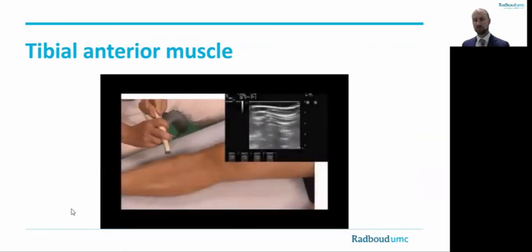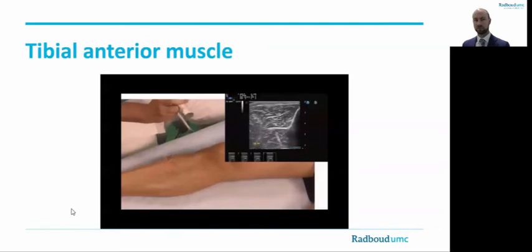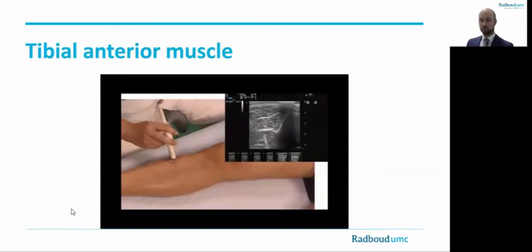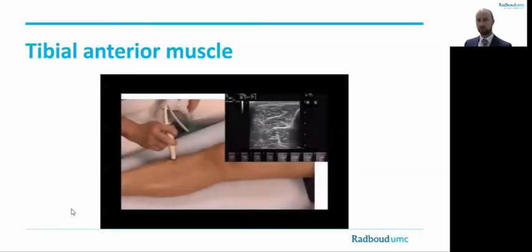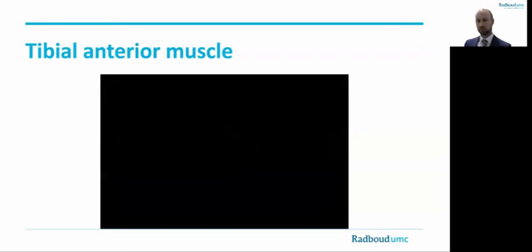The transducer is placed over the muscle in a transverse direction, with the left side of the probe aligned to the left side of the ultrasound screen. Please make sure that the probe has a strict 90-degree angle to the underlying bone or fascia. You can gauge this by assessing the overall muscle image brightness — the optimal image is where the underlying surface is most bright. The image is then frozen and the corresponding annotation is added. The image is saved and stored for further offline analysis. The probe is taken off the muscle and put on again two times to capture a total of three independent images. The third image is also used for the muscle thickness measurement using the electronic diameter calipers. After placing the calipers, the image is stored again.